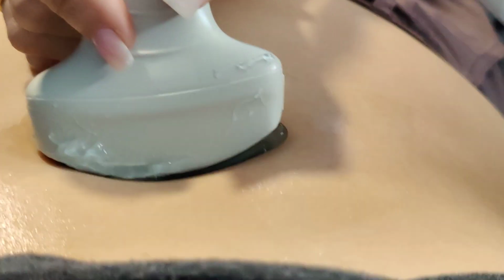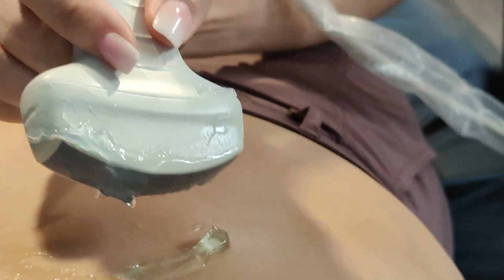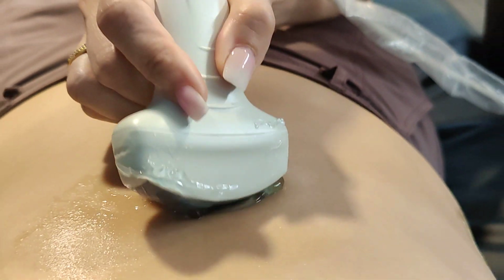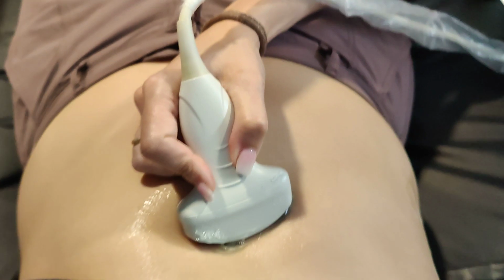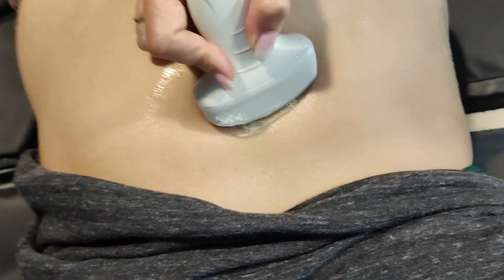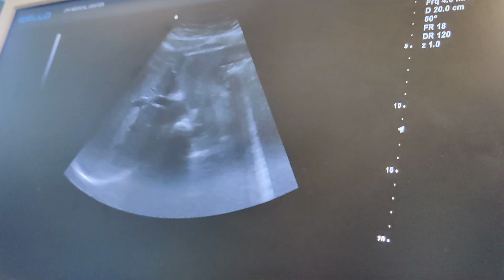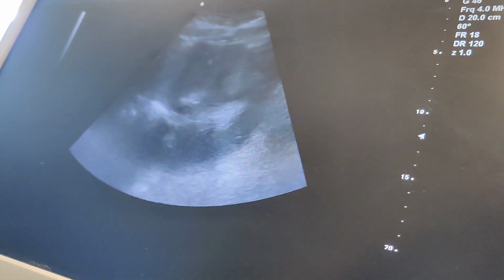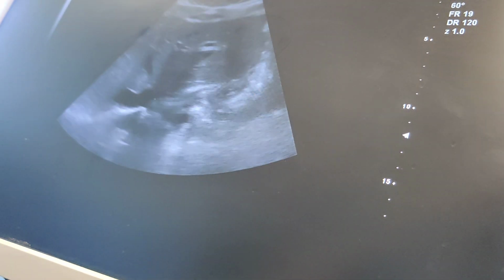Next, we're going to pretty much repeat the windows in transverse. So notch towards me, come back here. Again, I am slightly oblique. I have the notch pointed down and the end of the transducer pointed up a little bit. I'm going to decrease my depth back, and I'm going to evaluate the left lobe in transverse. So deep breath in. Just turn this down a little bit so you can see.